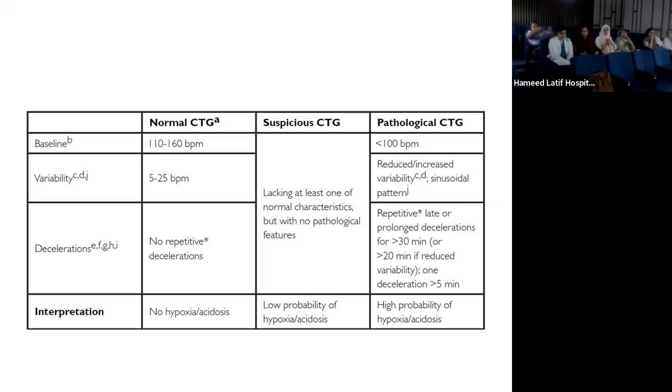So you clean the head with the sponge which you're holding with the sponge holding forceps. You clean it, then you see it, and by that time that woman is almost killing you. So there's somebody holding her leg. Either she is in left lateral or she is in lithotomy. Usually they're not in lithotomy because they're in first stage. So it's quite difficult and your back is killing you at the same time. Then they give you a spray. Then you spray that thing on the baby's head from a distance because the tube is like this.